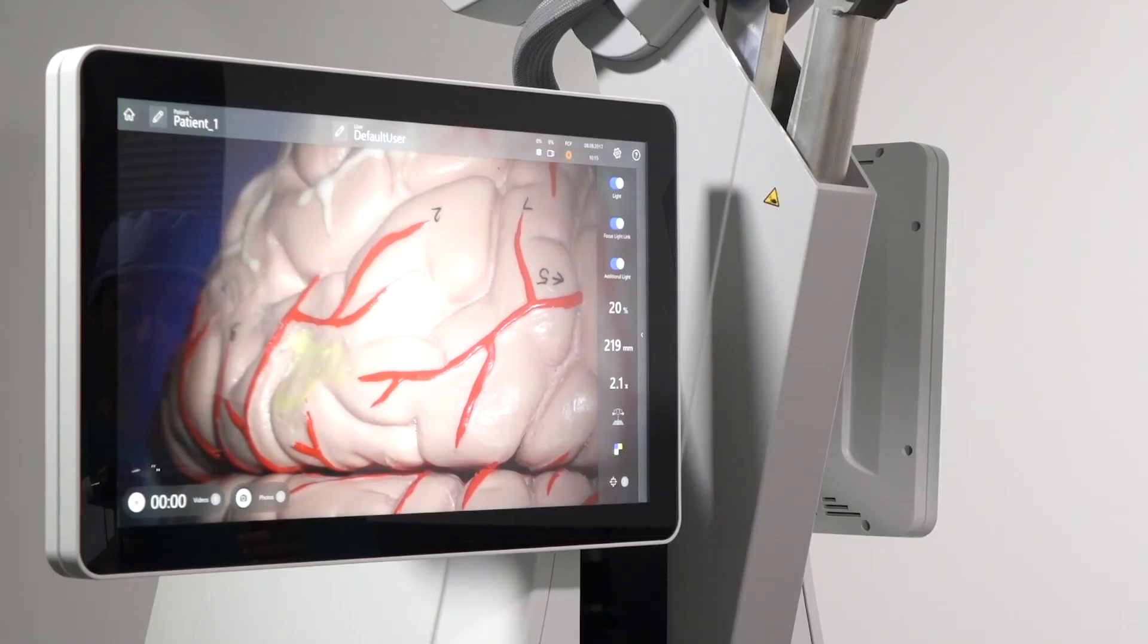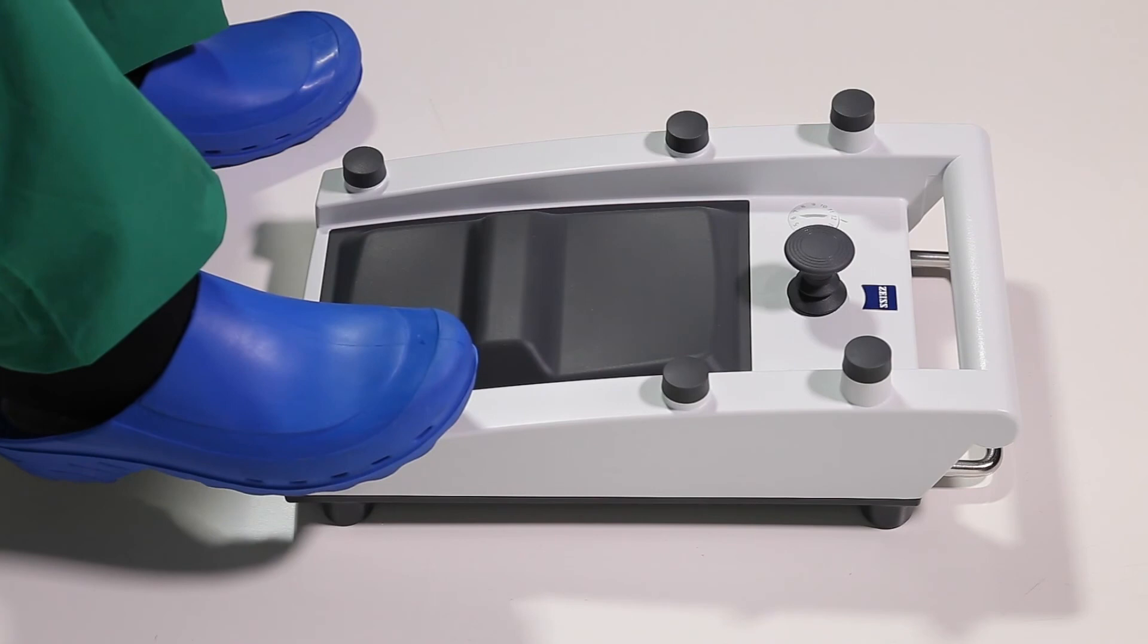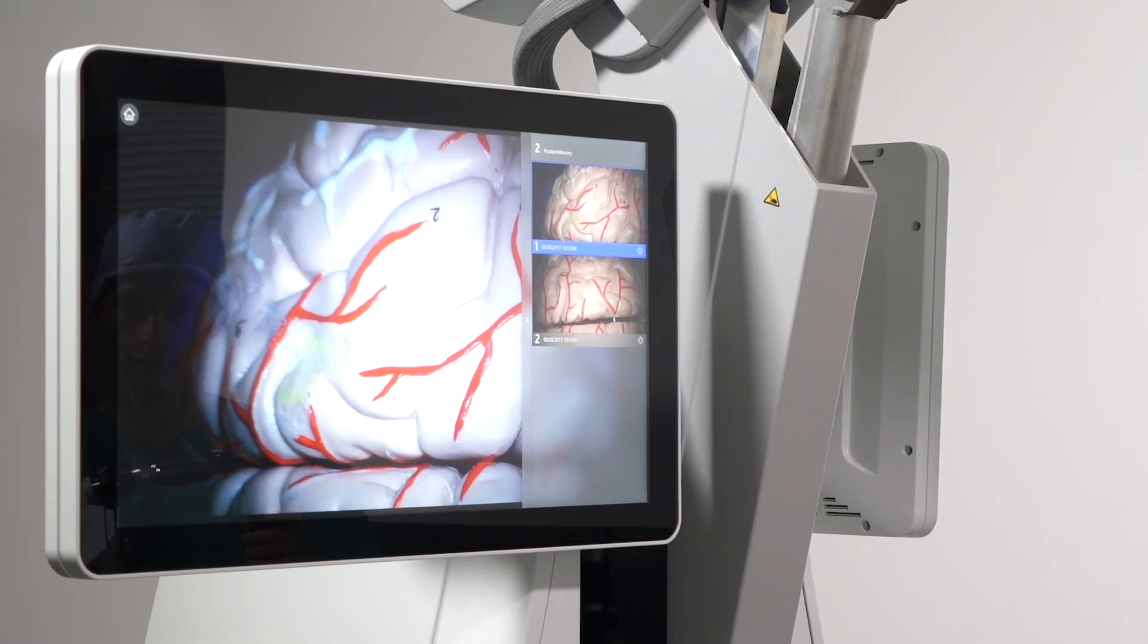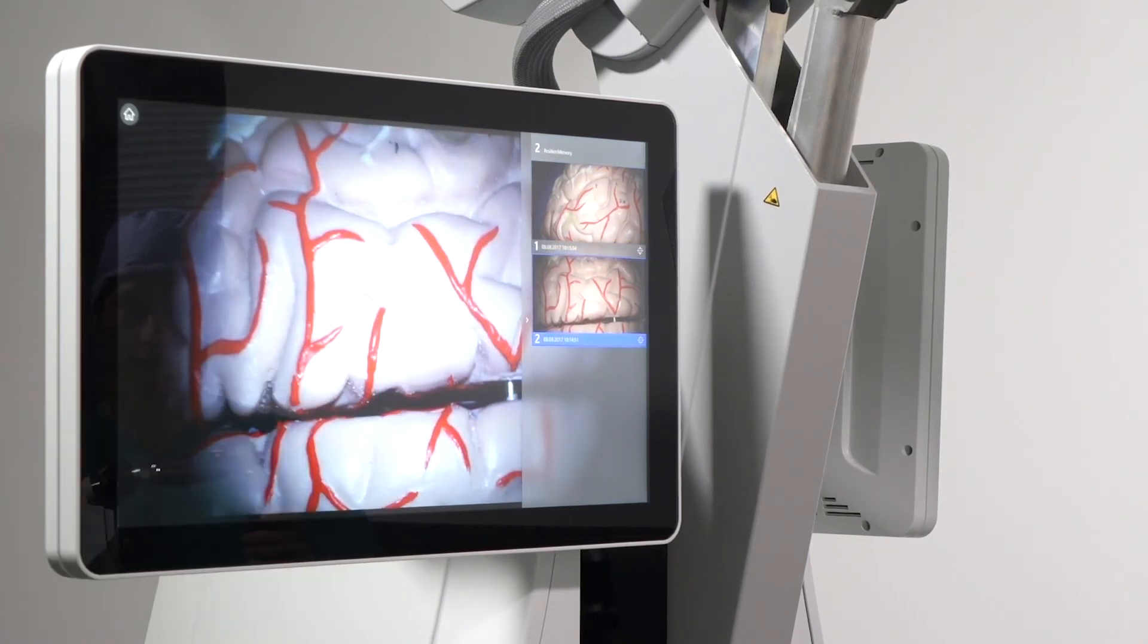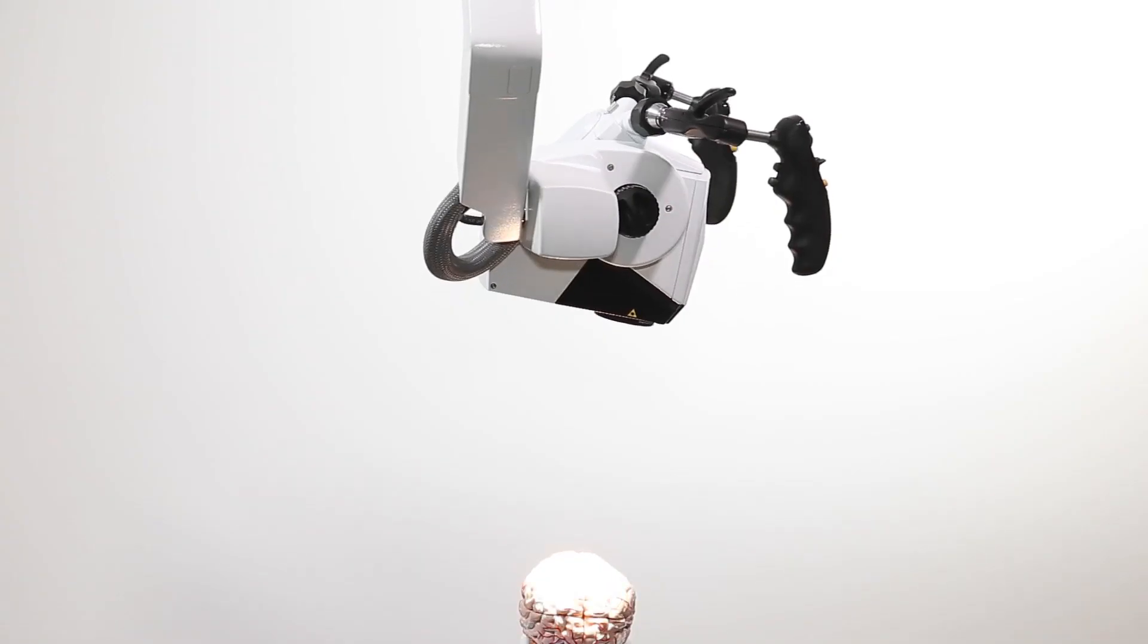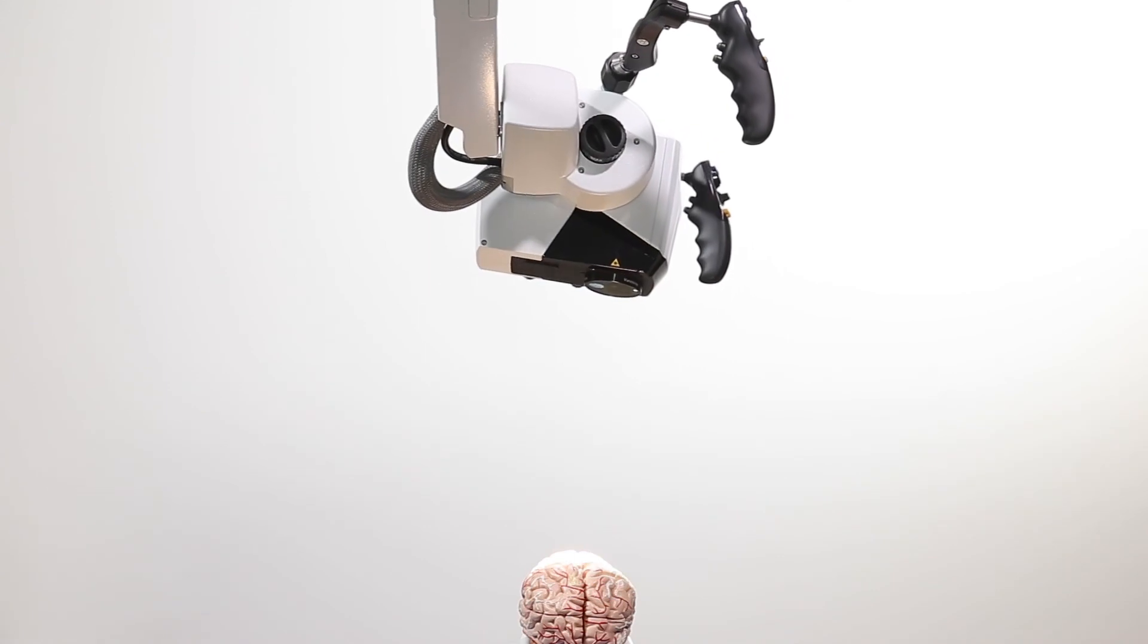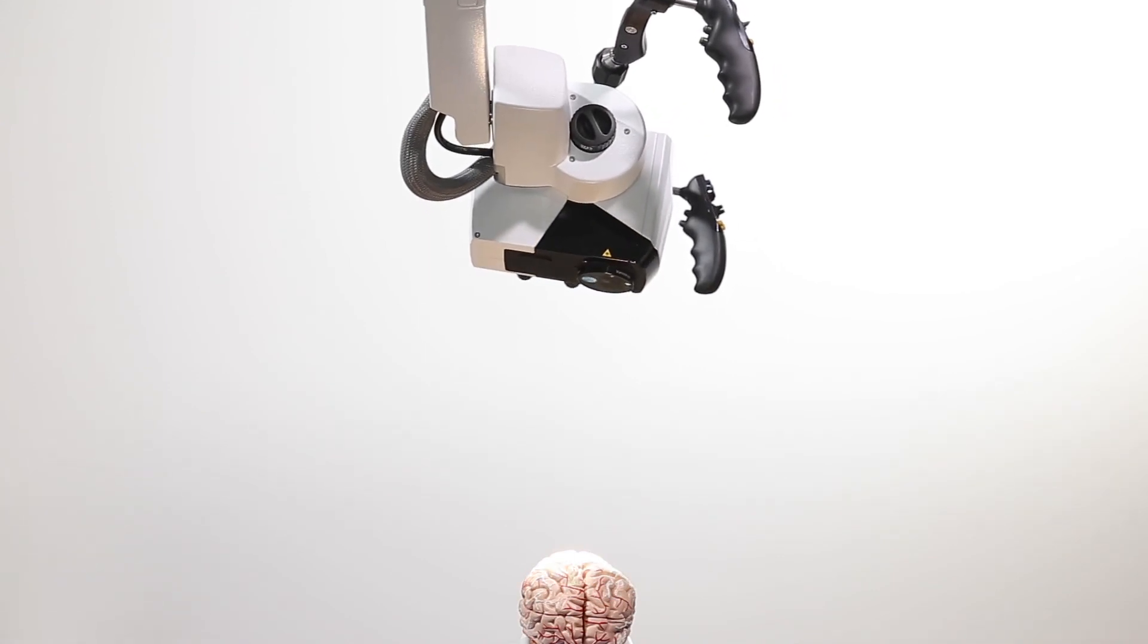To recall, long press the same button for 3 seconds. This will open the menu on the user interface with the saved positions. Select the position with the joystick, then press the joystick to the right to activate movement. The bing sound indicates that the position has been attained.